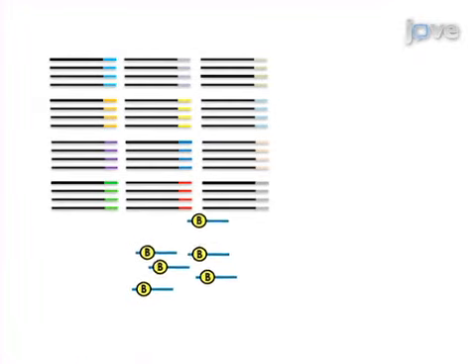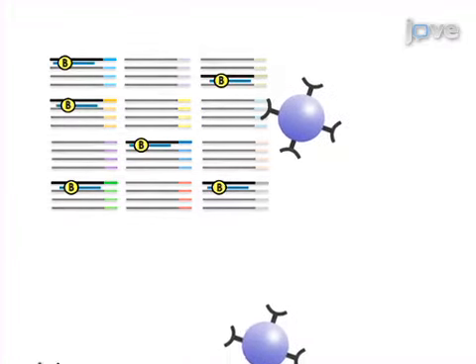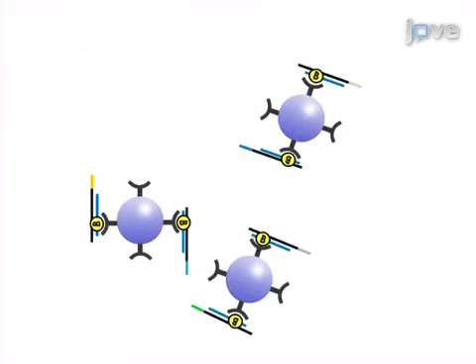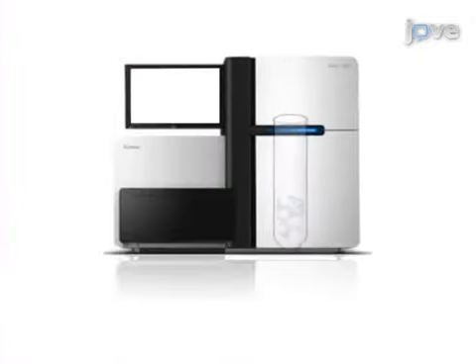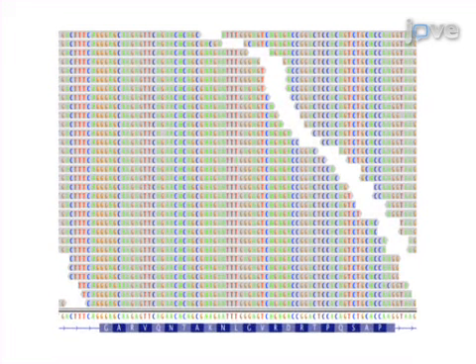The second step of the procedure is hybridization to custom biotinylated oligonucleotides complementary to all the protein-coding exons of 279 oncogenes and tumor suppressor genes. The third step is to perform massively parallel sequencing of the barcoded pools from the captured libraries. The final step is to search the sequence data for cancer-associated alterations.